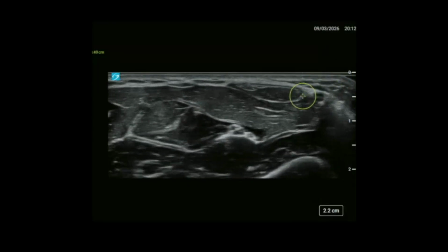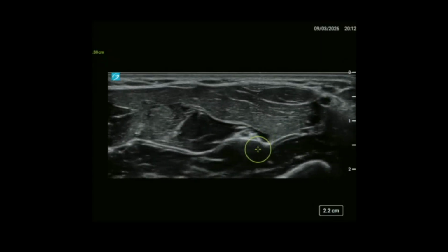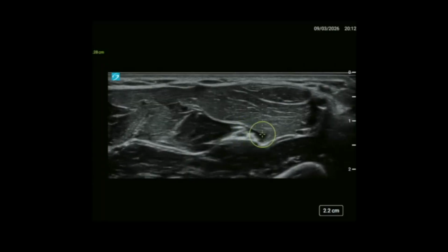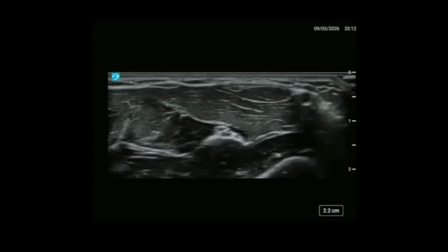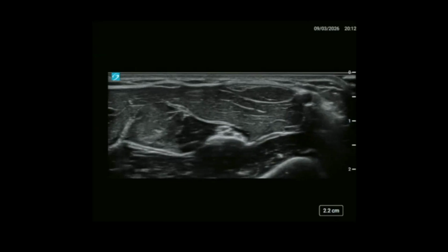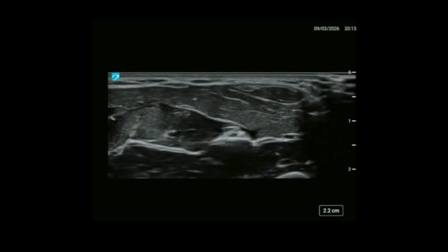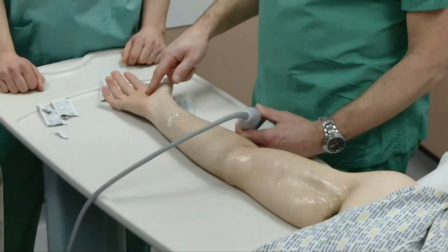Then we are coming down to come through this fascia tangentially, so we're not going to impale the nerve, and then I bring the tip of my needle back up gently and hydrodissect in to get around this space here. So this distal median nerve block would block the lateral 3.5 fingers. Okay, Sam, you've got the camera. So the lateral 3.5 fingers.